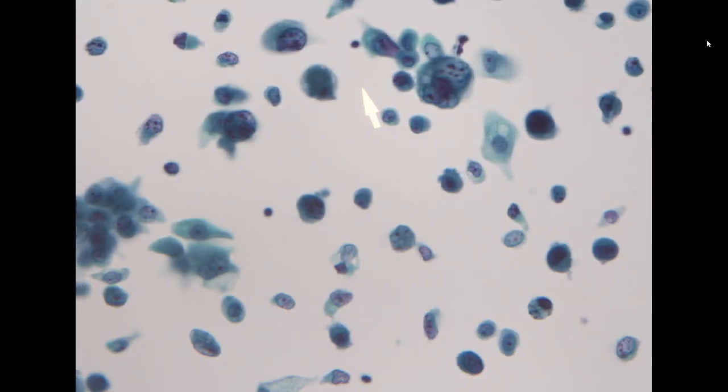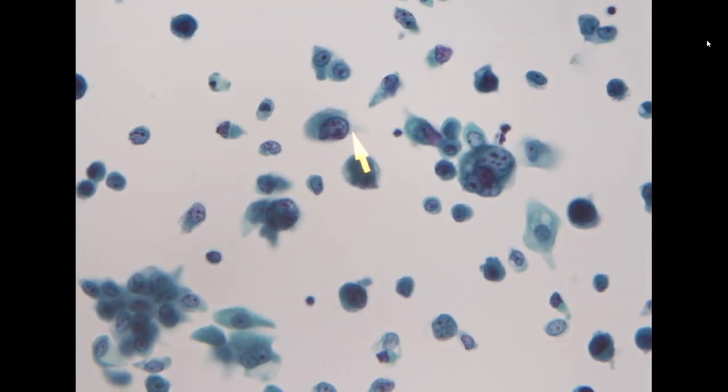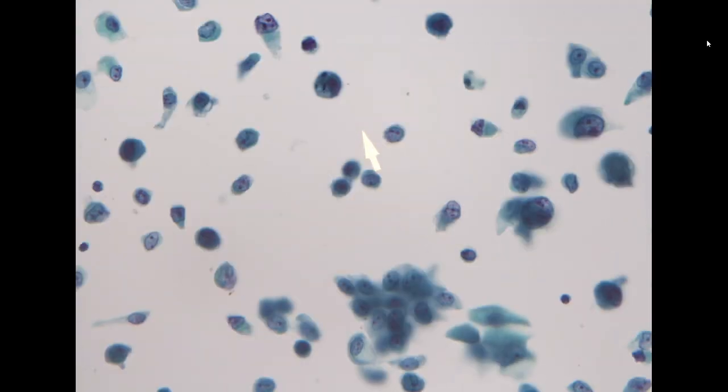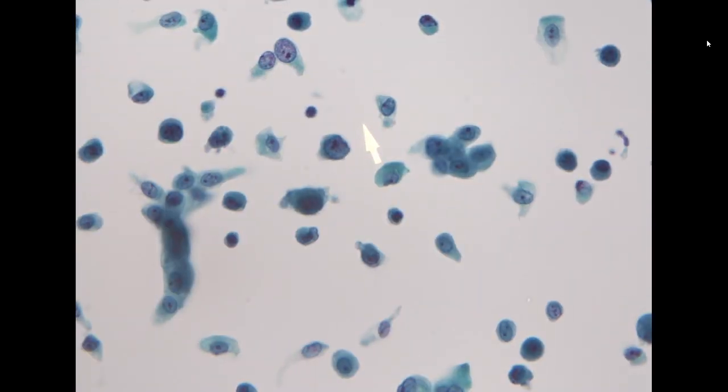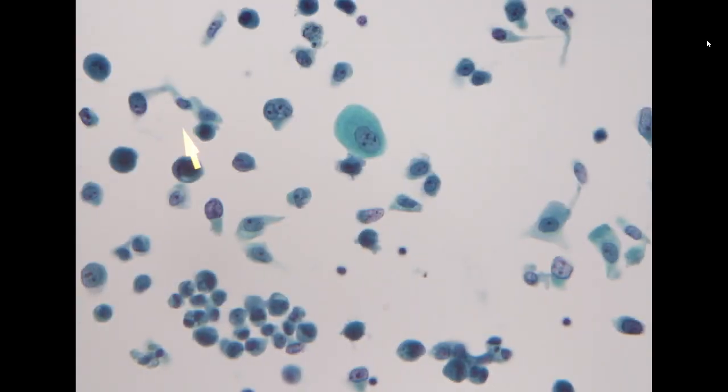And what I want to show is that not always all the high-grade urothelial cells have high NC ratio. For example, for this one, the NC ratio is probably 0.5 or even below. Okay? So sometimes, not always, the high-grade UC cell will have a very high NC ratio. You need to be aware of that. But otherwise, the majority of the cells show definitely high NC ratio and hyperchromasia.